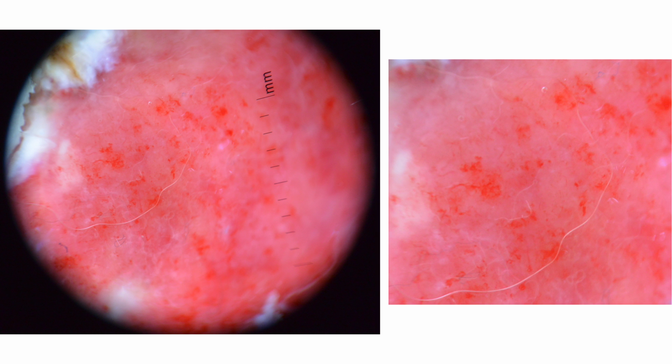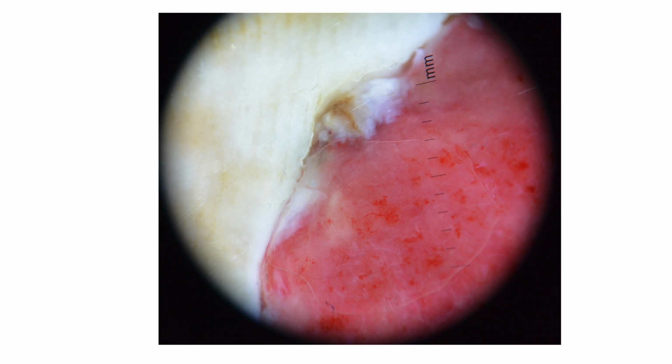We can also see there are many vessels. These are polymorphous vessels, meaning some are linear irregular, some are red and globular, others are microulcerations. In addition, there are signs of shiny white lines and some areas of scar-like depigmentation. In contrast to acral lentiginous melanoma that has a parallel ridge pattern, acral amelanotic melanoma may not have much pigment at all. In fact, here at the edge, we have one little hint of pigment, but the most important features we're seeing are atypical polymorphous vessels and shiny white lines.